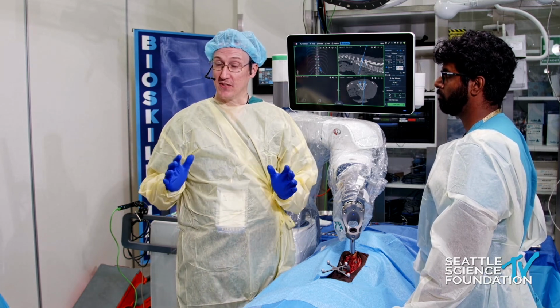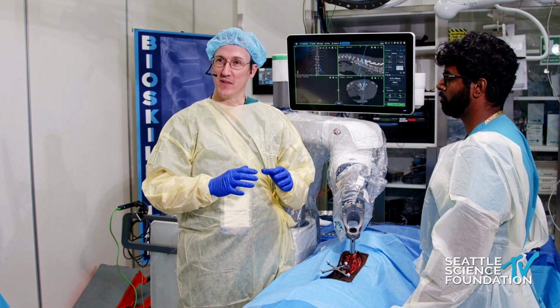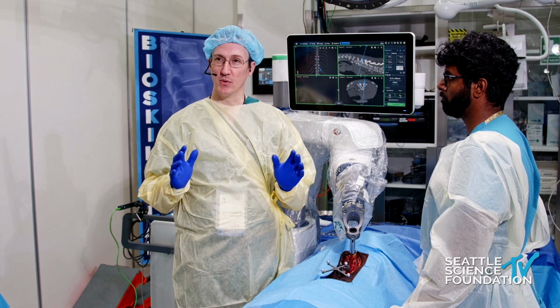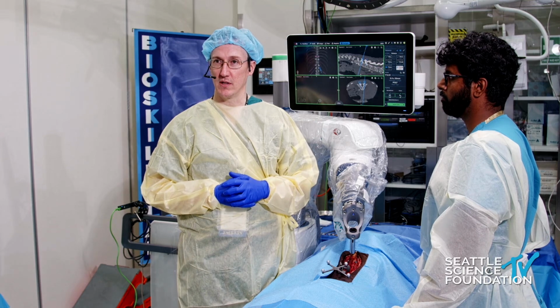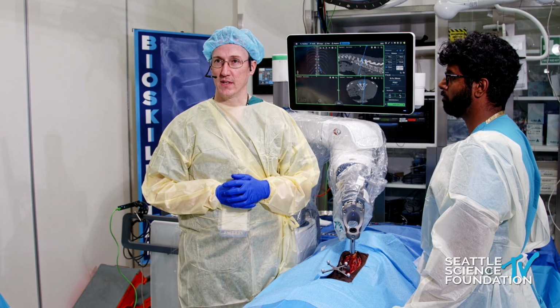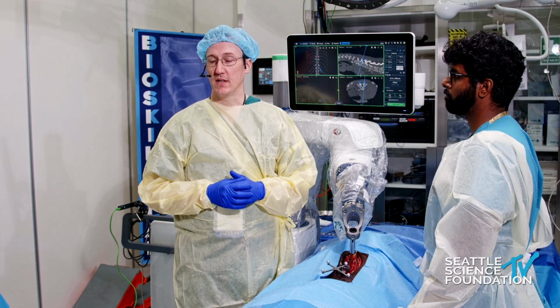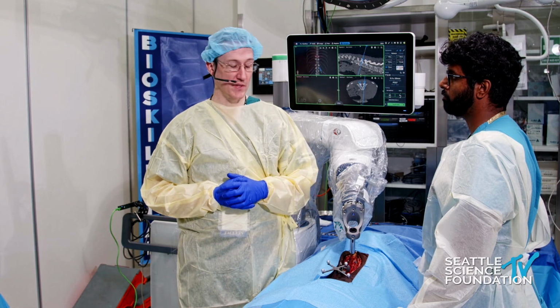I'm super fascinated by the presentation on the AI about where the stresses are going to be. If we instrument this level here and stop this, is this going to be a red zone? Blown away. I'm looking really forward to seeing that become a practical application for us. I think that will change what level we are going to use for our final cephalad and caudal aspects of our constructs. I think it's going to be important.